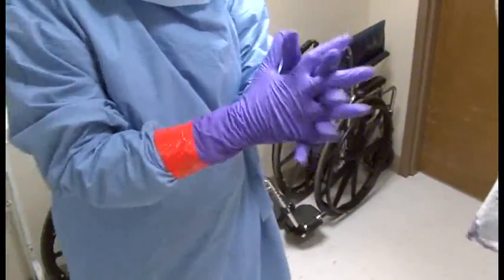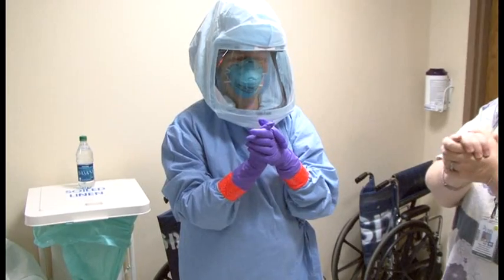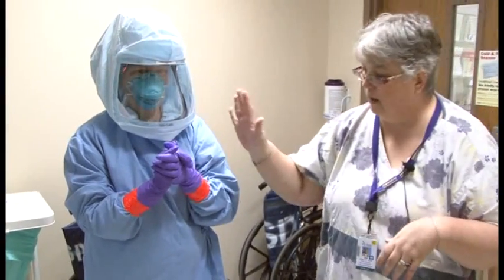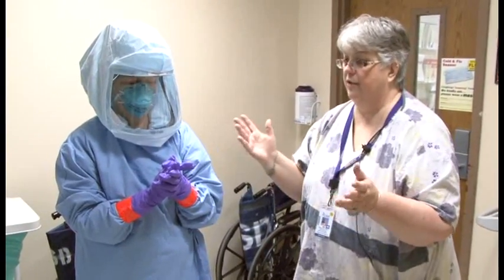Lynn stands with her arms positioned so she doesn't contaminate her gloves or get her gloves contaminated by anything on her gown. Lynn is now ready to go into the room. When isolation is called, Fast Track will jump into action and get the room ready for the suspect patient.